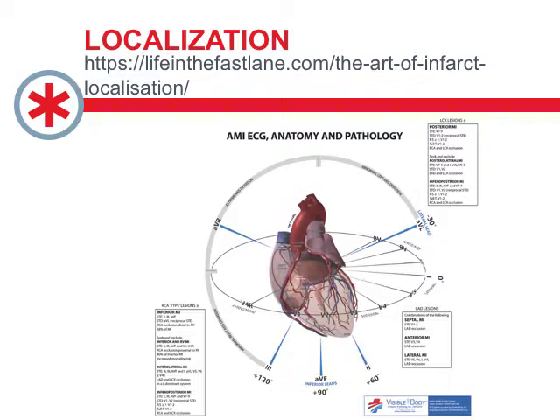Now, if you joined us through the earlier parts of these lessons and had gone through all our ECG leads teaching, one of the ways to remember which ECG leads go where is that if you take the positive electrode of the lead, where that sits is basically the end of the heart that it looks at. So if you look at, say, lead 1 or AVL, this is on the left side of the chest. AVL, of course, going towards the left arm, lead 1 going straight right to left. And of course, that's the lateral aspect of the heart.